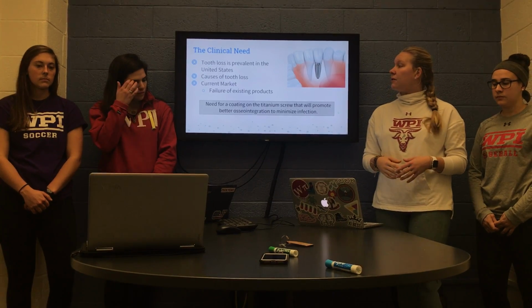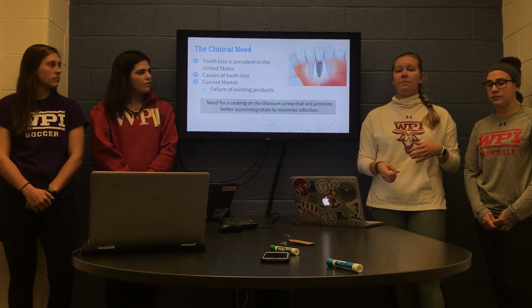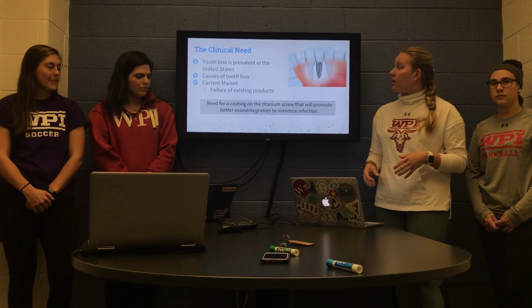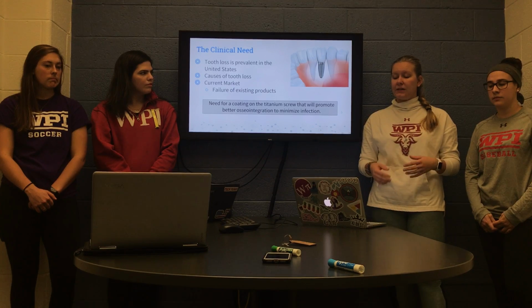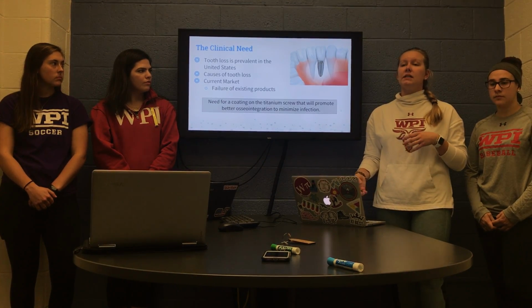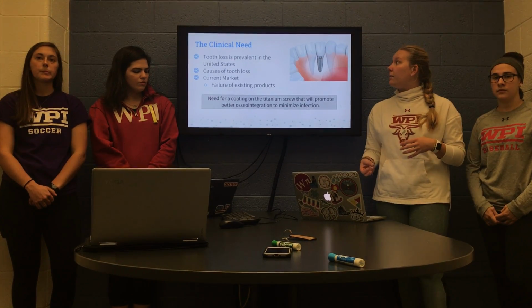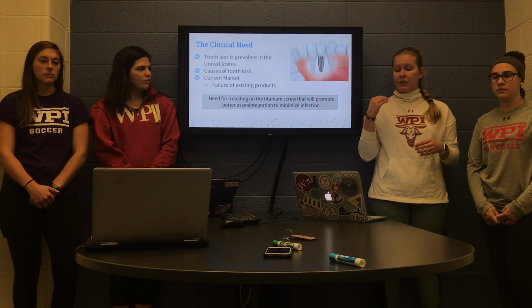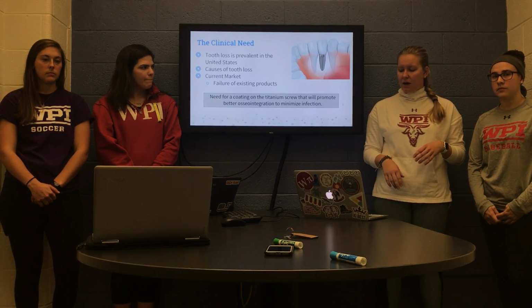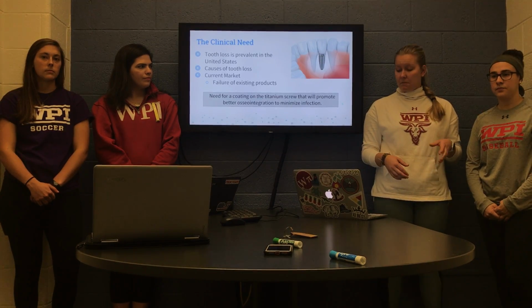So the most common mode of failure for these screws is infection, which causes bone deterioration in the jaw. Also, if you have poor dental care, it causes increased risk of infection because the implant isn't being taken care of to its fullest potential, therefore causing bone deterioration in the jaw. And this can have an effect on the surrounding tissue and surrounding teeth, and this is called mucositis.